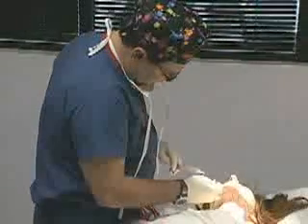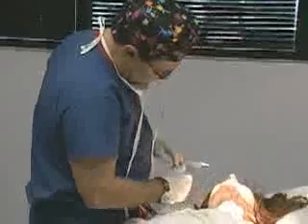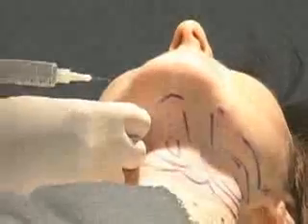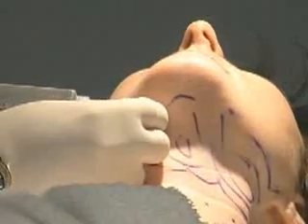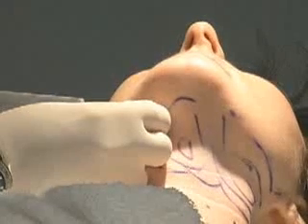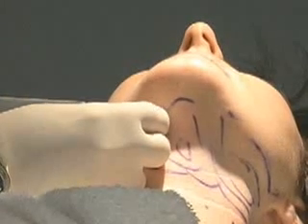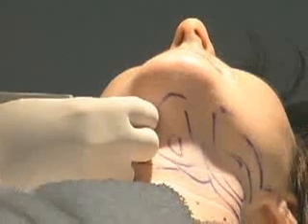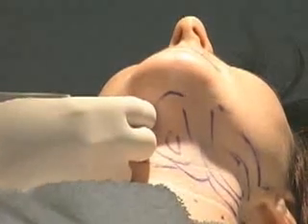Now we're going to put just a little numbing medicine in these areas that I've marked with little blue dots, and that's where the actual holes will be made with a tiny knife blade to insert the tube in. Both the water will be placed and the fat will be extracted. Okay, you take a little pinch here. And we put this in very slowly so that it's not that uncomfortable to the patient.